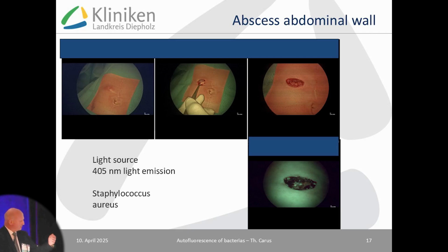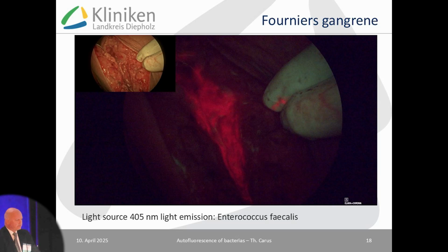The bacteria you can show in the camera, there are the bacteria, and you can then show that the wound is clean. Another interesting case, 6 weeks of therapy in the clinic and 20 operations, a patient from last month with Fournier's gangrene. This was the second revision.